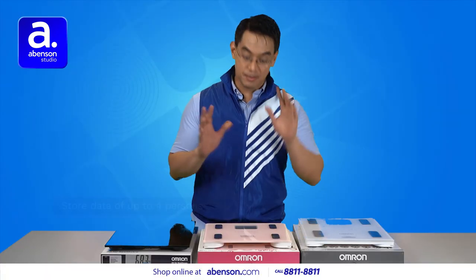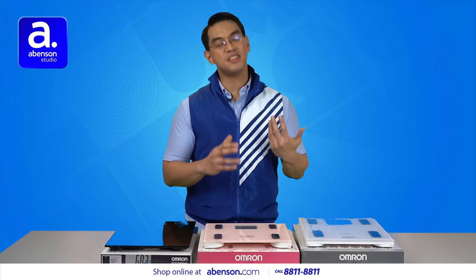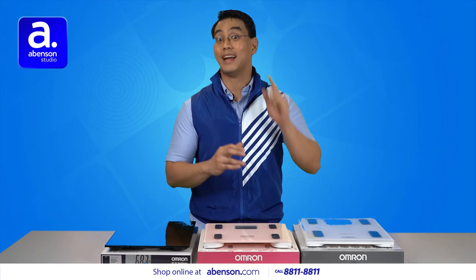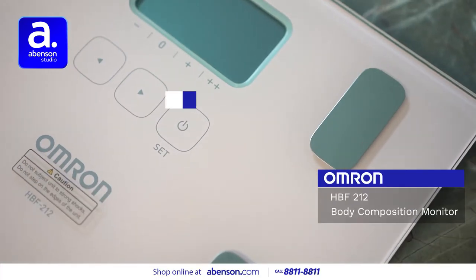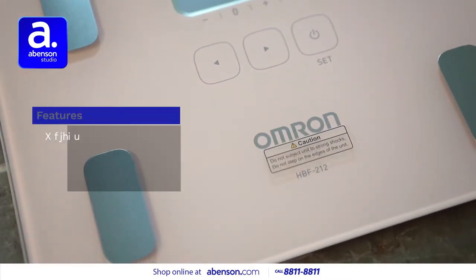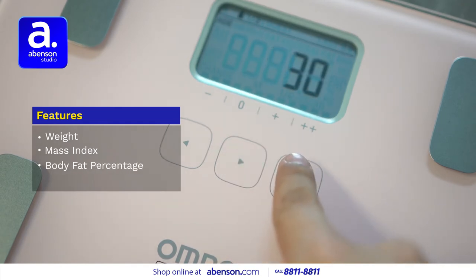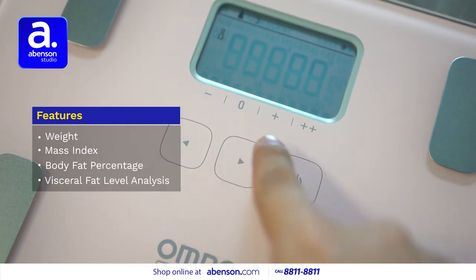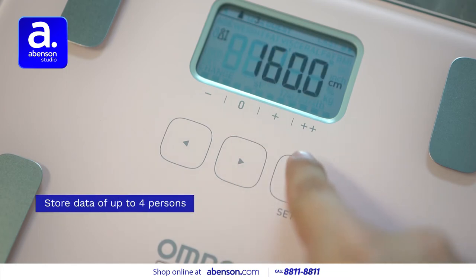Lastly, we have the body composition monitor HBF212, which is kind of similar to the HBF214, except it's for kids — specifically, children ages eight years old and above. It comes in a very cute pink color and can show you your weight, body mass index or BMI, body fat percentage, and visceral fat level analysis. Plus, it can store the data for up to four persons.